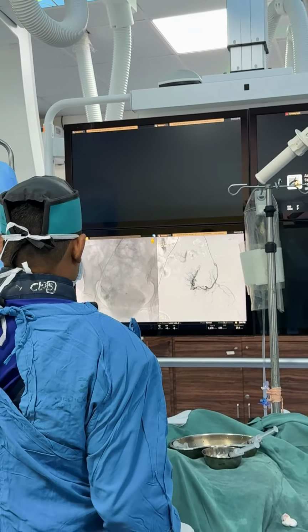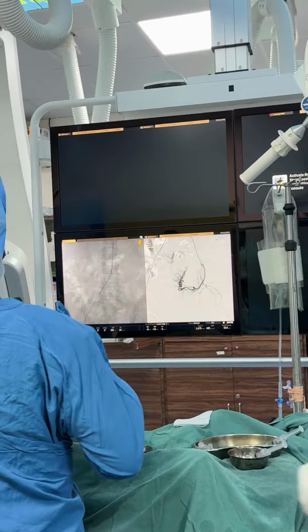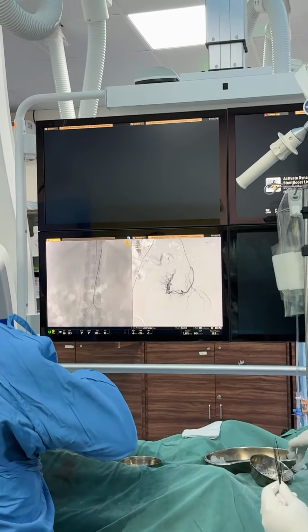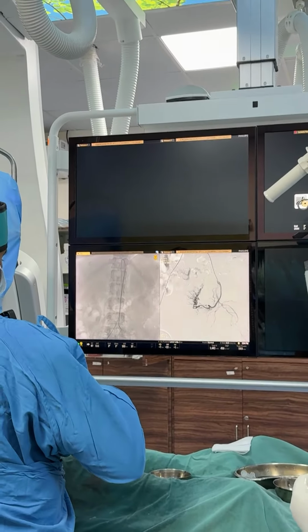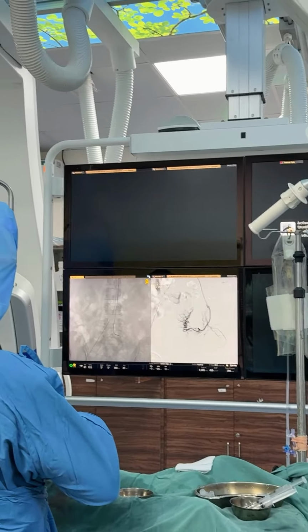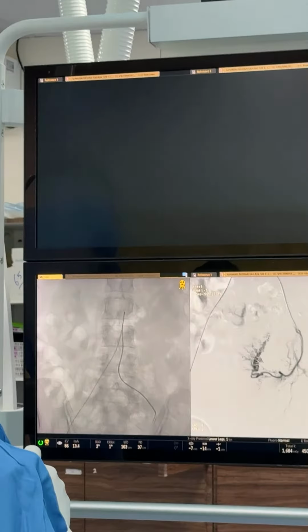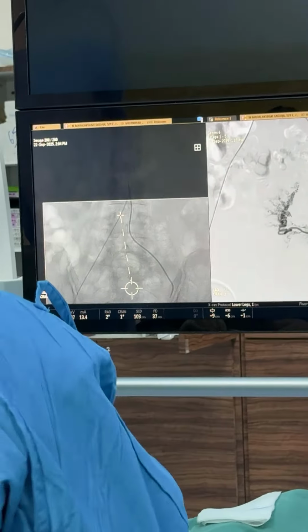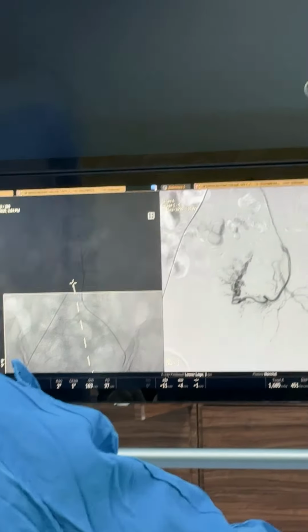Table. So we take out the RUC. Right. Wait. So you should not be in a hurry. You can break the catheter, you can create a complication after a successful procedure. So it's very important to do everything under vision.